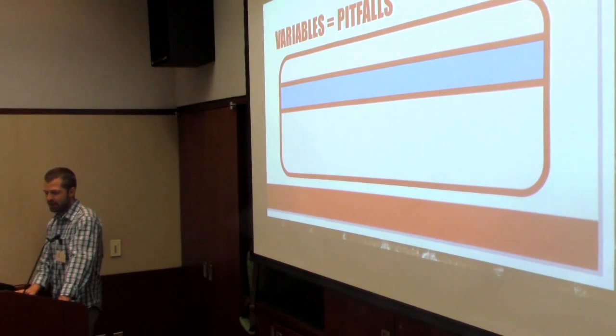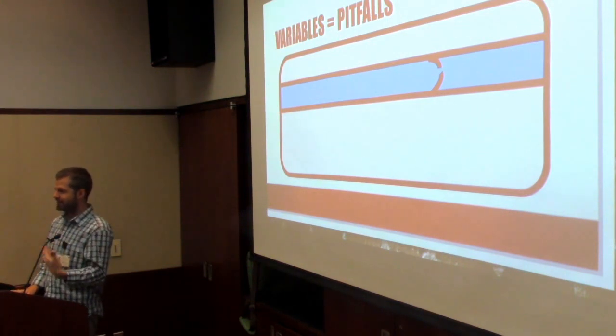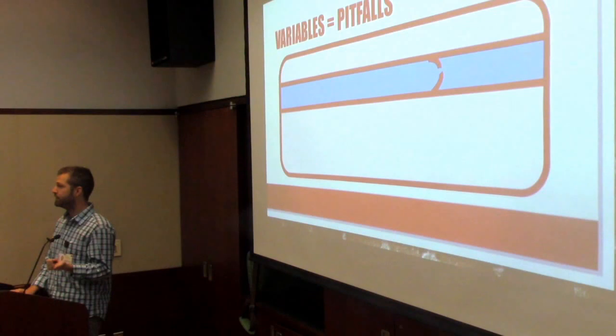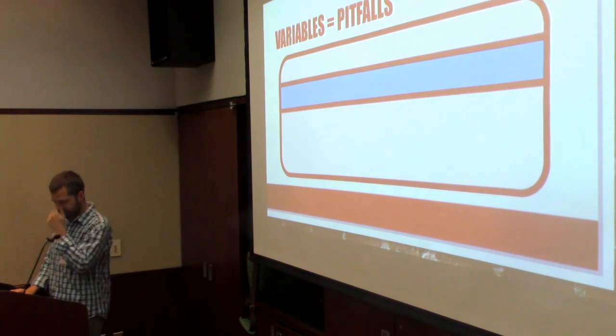So, talked about valves. That's a valve. In a lot of these procedures, things fail for the same 5 or 6 reasons in general. If you've set everything up flawlessly and it's a pure technical error, if it pops a little bit later, it's probably because there was a valve. So if you stab a valve, or stab near a valve, it's less likely to be a long-lasting line.